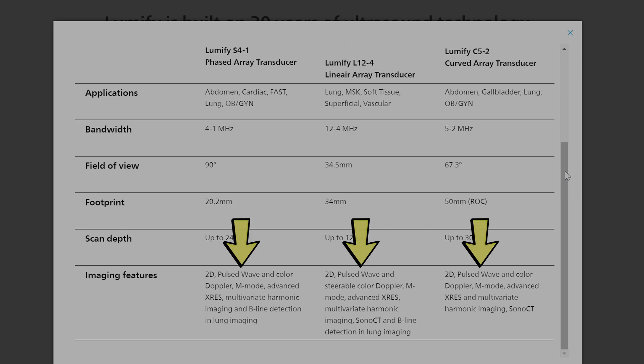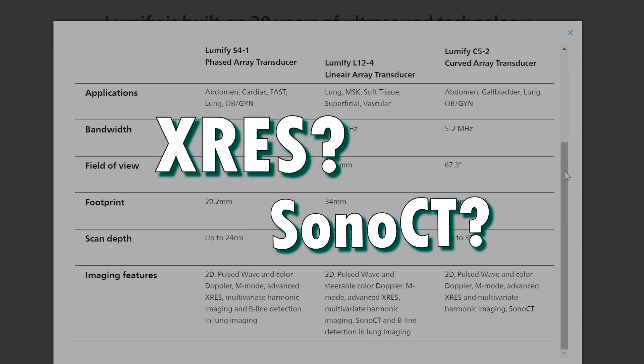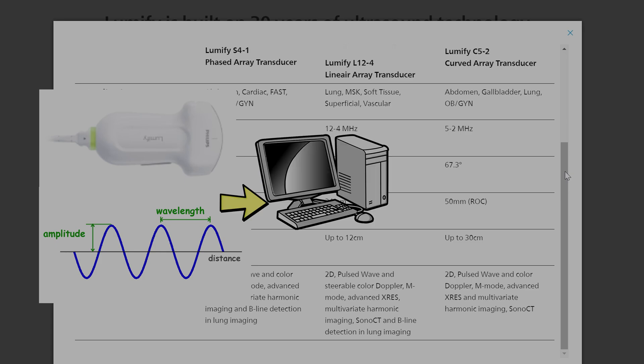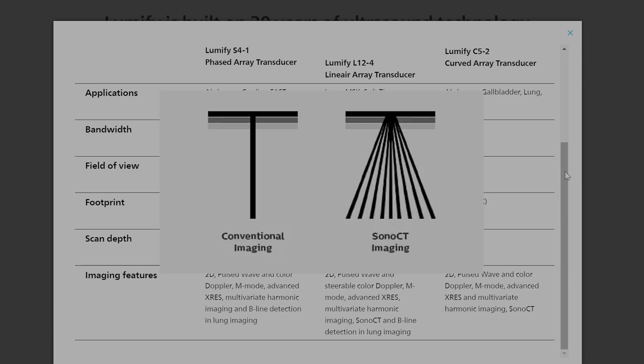All of these devices have grayscale, color, and M mode. But what is X-Res and SonocT? X-Res is essentially the way that the ultrasound data is compounded into a picture and displayed using algorithms to sharpen borders and smooth tissues. SonocT is Philips' brand of compound imaging — it uses multiple beams to sample the tissue and compound it into a single image.